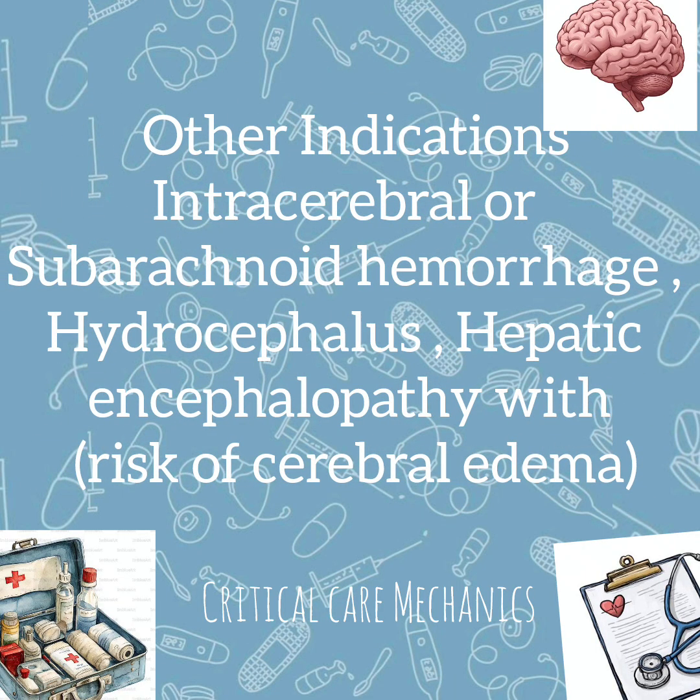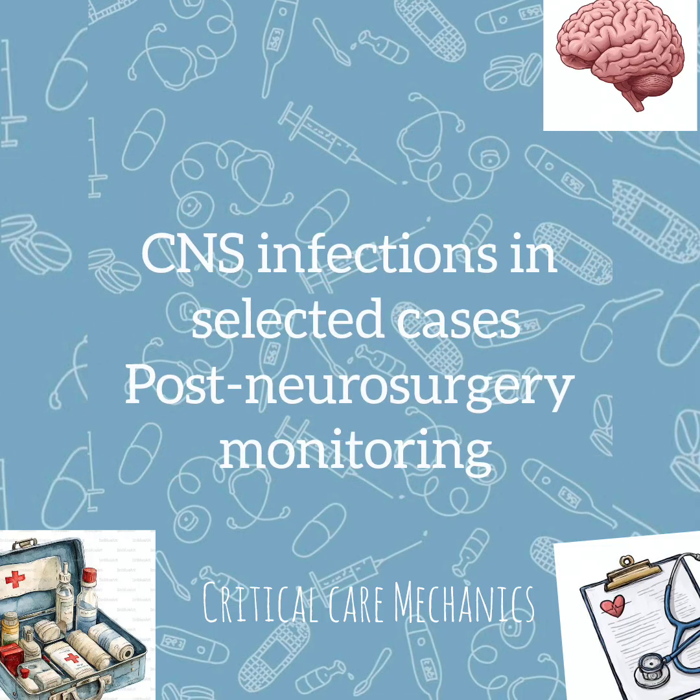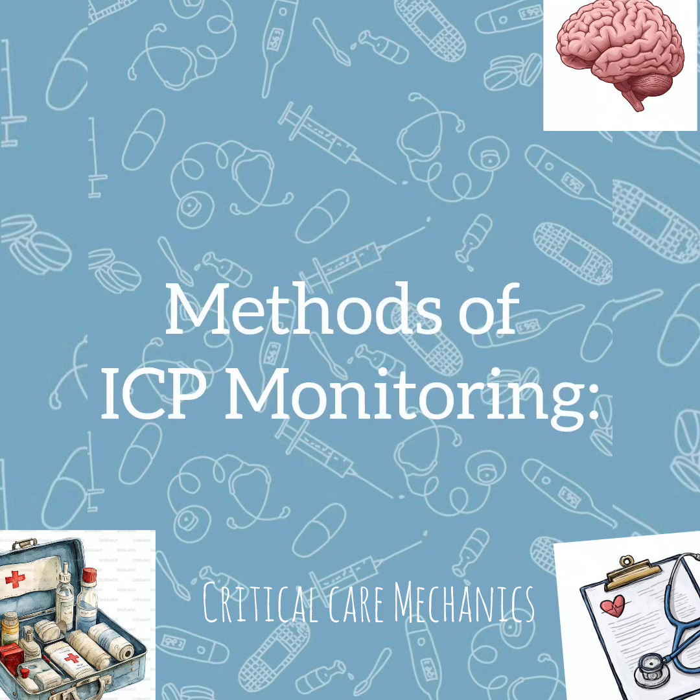Other indications: intracerebral or subarachnoid hemorrhage, hydrocephalus, hepatic encephalopathy with risk of cerebral edema, CNS infections in selected cases, and post-neurosurgery monitoring.